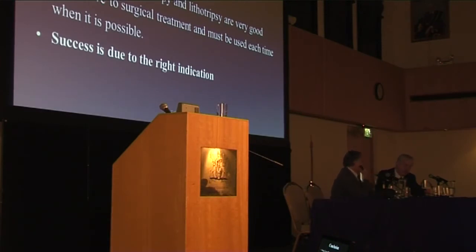Can I just ask you, and maybe I didn't understand it, when you do your lithotripsy and you've broken the stone down into multiple fragments, why aren't you at that stage doing a sialendoscopy and removing those fragments? No, because we cannot put the endoscope during the lithotripsy because you will choke the endoscope and break it. Okay, because the shock wave is quite powerful. No, I mean after. It's bleeding. Right. We try, but it's bleeding inside, so we have to wash. And the patient also had a session with 4,000, 5,000 shock waves. If you put in the endoscope after and try to remove the stone, no, it's not good for the patient.